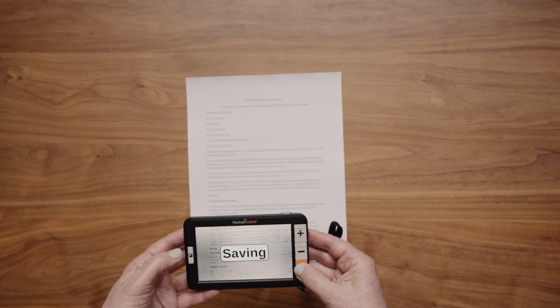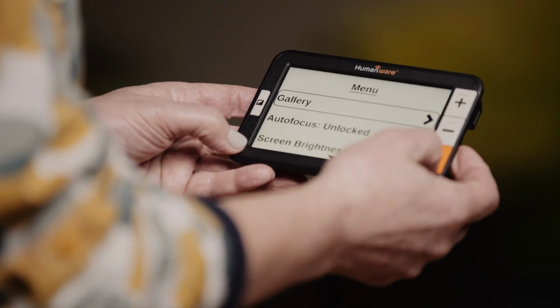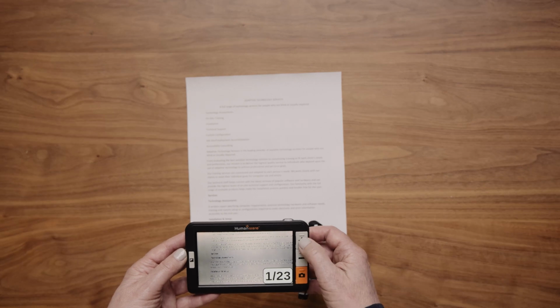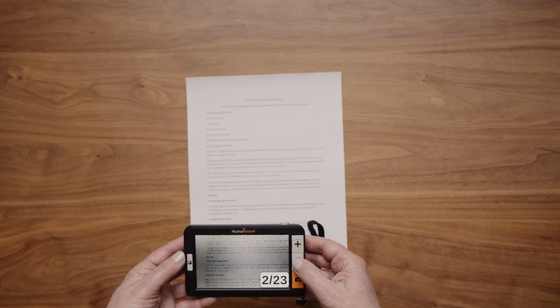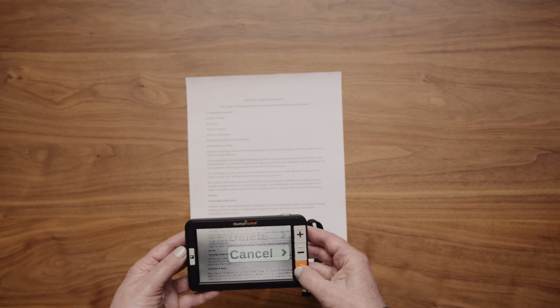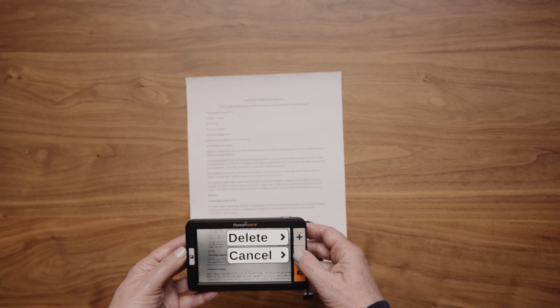Use gallery mode. Press the contrast and freeze buttons simultaneously. Cycle through images in gallery mode. Press the Zoom In plus or Zoom Out minus button. Delete images from the gallery. Press and hold the freeze button. Press the Zoom In plus button to confirm or Zoom Out minus button to cancel deletion.